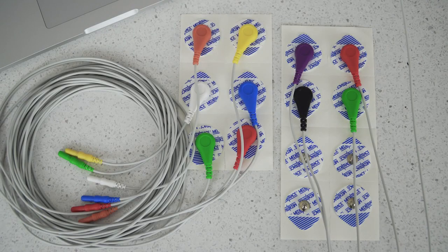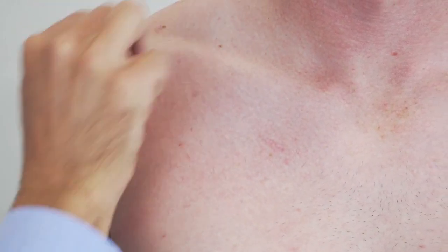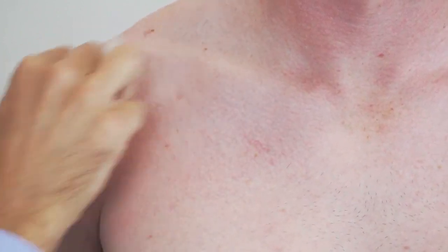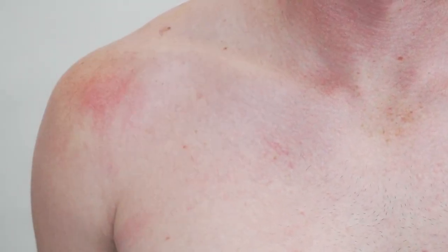Before placing the electrode it's really important that you prep the skin. We use these skin cleansing swabs, which are actually just alcohol swabs, and we just wipe down the area really well. This is just to remove any oils which can cause drift in your signal.